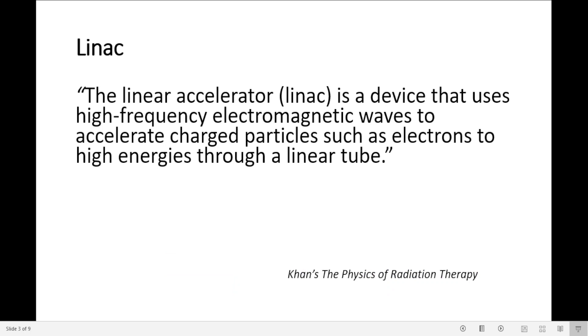The linear accelerator, or LINAC, is a device that uses high-frequency electromagnetic waves to accelerate charged particles, such as electrons, to high energies through a linear tube.